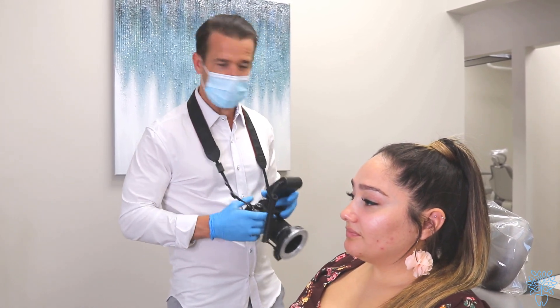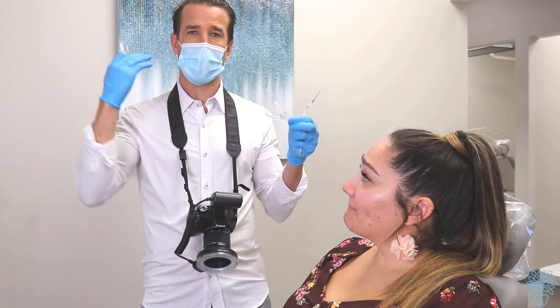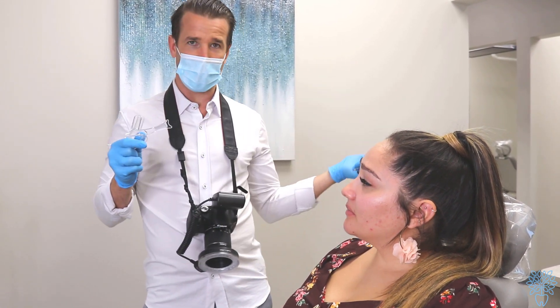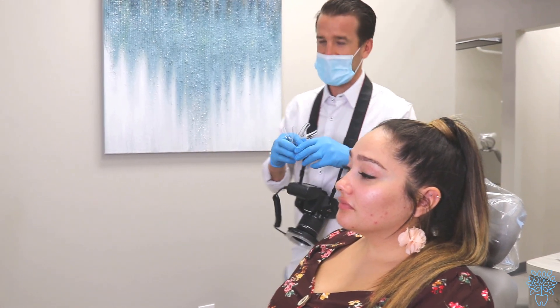Step one is to turn everything on. The three tools we're going to use are these cheek retractors — they go for the front of the mouth and the sides — and then we're going to use this instrument along with the mirror for the tops and the bottoms.